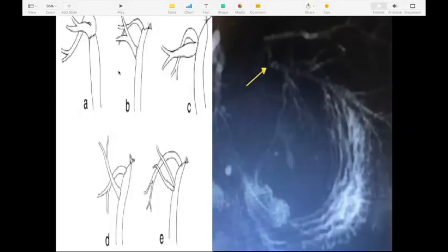And these are the ducts which I was saying. This is the single duct anastomosis. This is the double duct anastomosis. This is a triple duct anastomosis. So three duct anastomosis, to different portions of the jejunum. So in the near future, we may see such patients because of complicated intrahepatic anatomy. And ERCP is the purpose, because you can see that the IHBRD is not there, and these patients may require enteroscopy, because EUS may also not help in these patients.